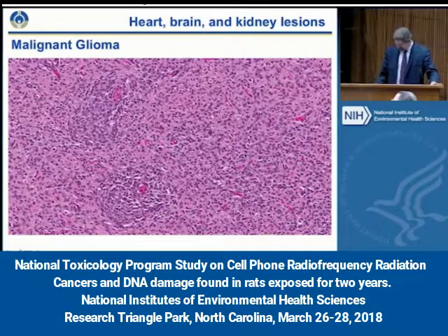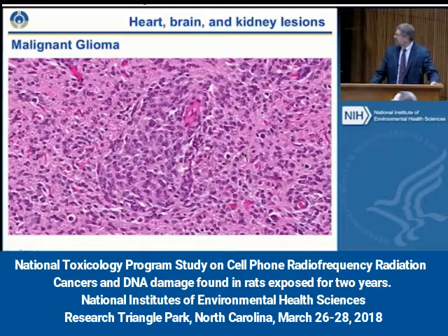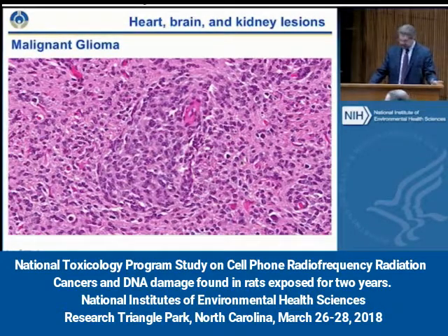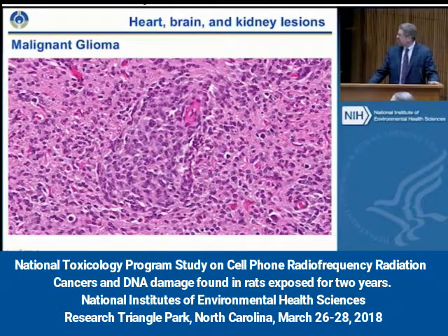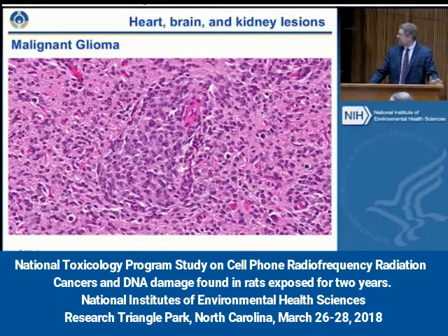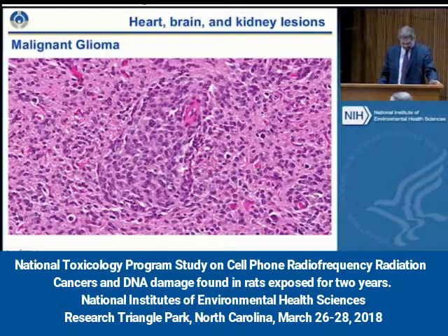Here I have higher magnification. You can see the pleomorphic nature of these cells — some are a little bit larger and have more cytoplasm with slightly more open nuclei, while some are smaller and have darker nuclei and less cytoplasm. That's very typical of these neoplasms.